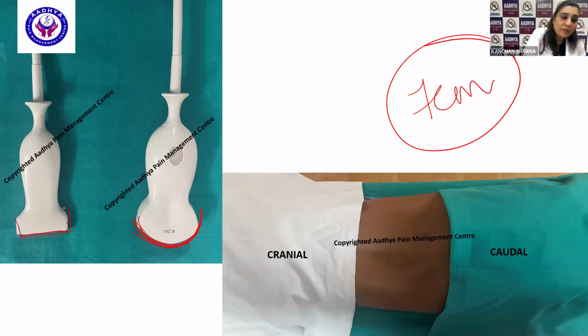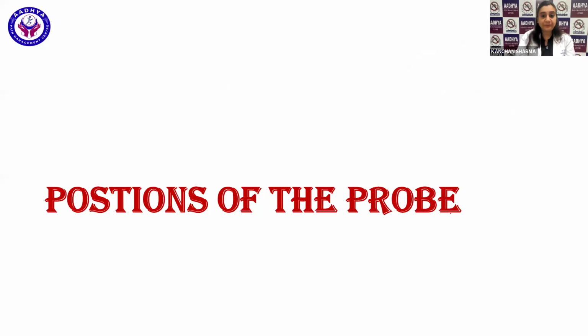Now, in order to visualize the spinous process, we will be using this probe, right? I'll be showing you that. And you can examine the patient in the lateral position, in the sitting posture, of course, in the prone position as well. As a pain physician, I prefer this position because I'm tuned to do all the interventions in the prone position.